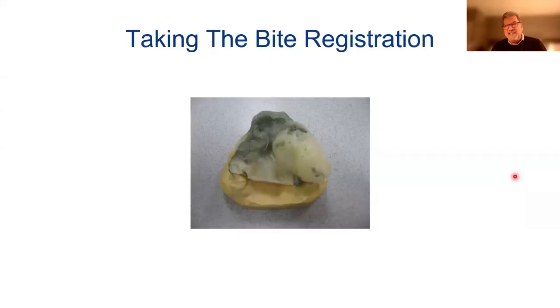And I couldn't get that lower counter model to fit into this wax, no matter how hard I tried. So I asked the doctor, I said, Doctor, I got this bite registration. I'm having a hard time with it. And he told me the 5 words I hate to hear most in the laboratory.